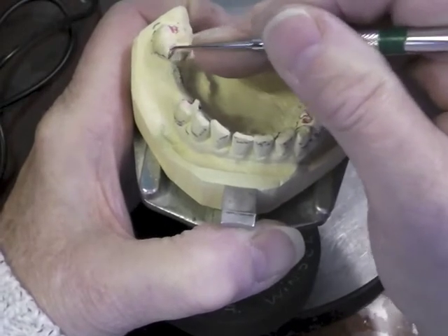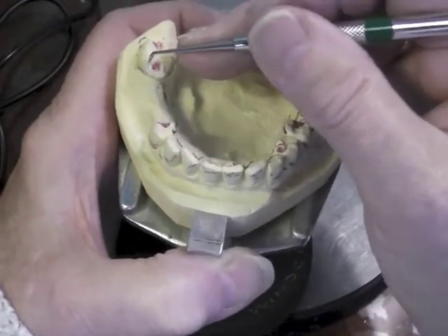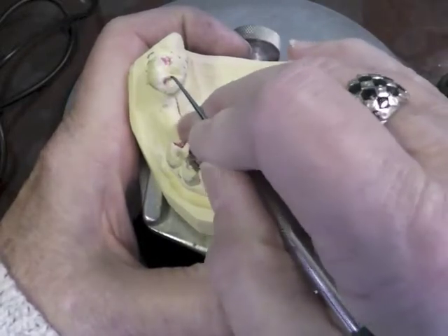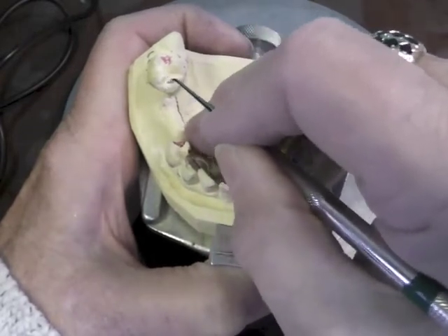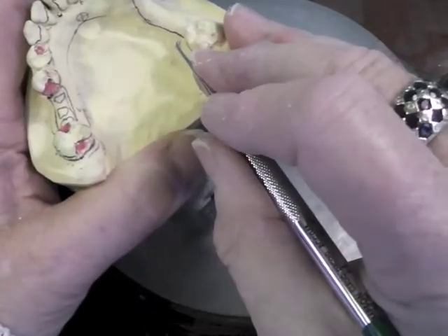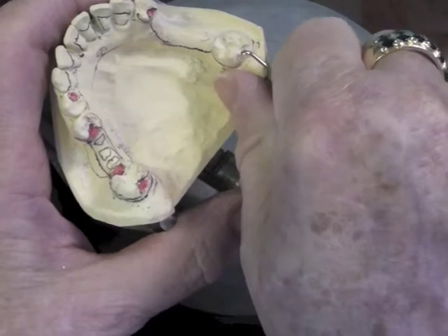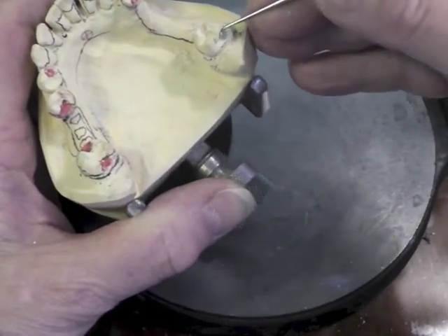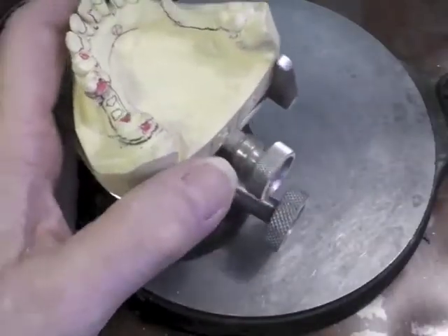I might lower that survey line just a little bit right there to have a nice transition for my arm. On this side, we don't need to because our direct retainer is going to end right there. So our rest — lowered at least a millimeter at the marginal ridge, spoon-shaped, this point deeper than the marginal ridge — I'm going to go ahead and prep this one too. I have an arm coming this way from this direction. I have a little sluiceway going this way. I want a spoon-shaped rest, no steep walls, so I have to expand this a little bit. And this point deeper than the marginal ridge.